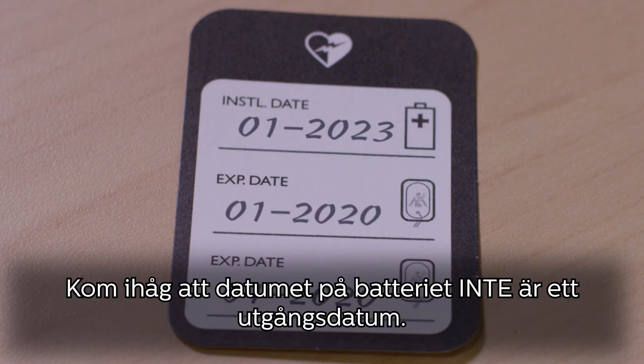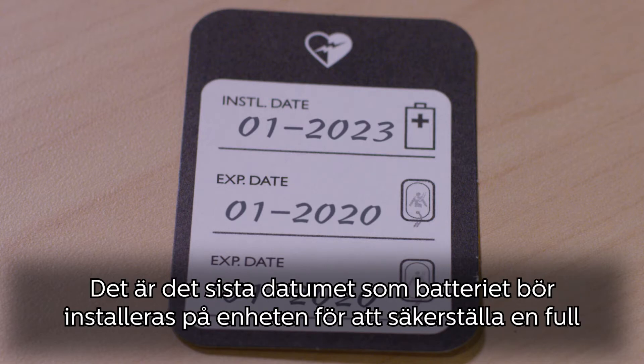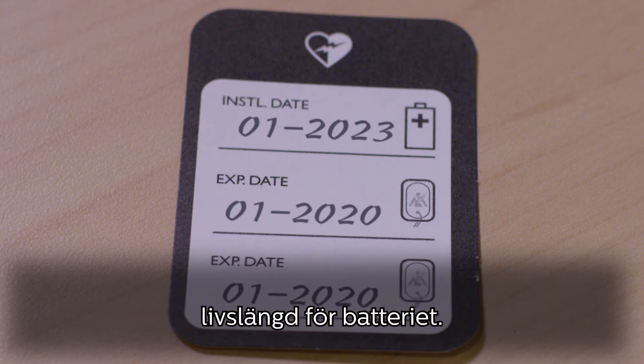Keep in mind that the date on the battery is not an expiration date. It represents the latest date the battery should be installed into the device in order to ensure full battery life.